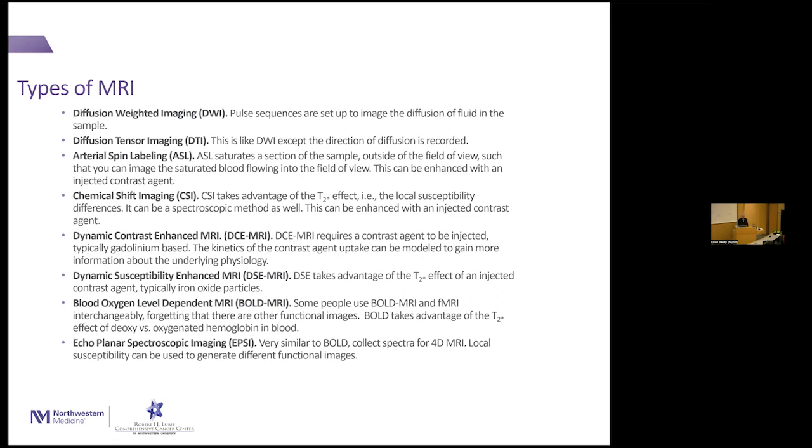Dynamic susceptibility enhanced MRI is similar to dynamic contrast enhanced MRI, but it uses susceptibility. So it's typically something like an iron oxide agent.